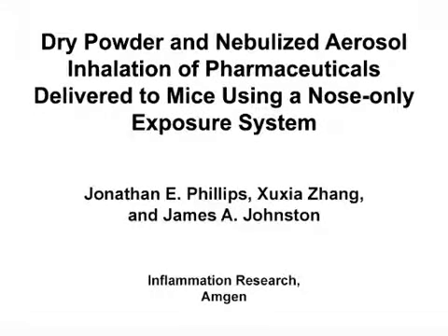The overall goal of this procedure is to generate aerosolized drug samples for their characterization and uniform deposition into the lungs of rodents. This method can help answer key questions in the inhalation pharmacology and toxicology field about the safety and efficacy of specific doses of inhaled drugs.